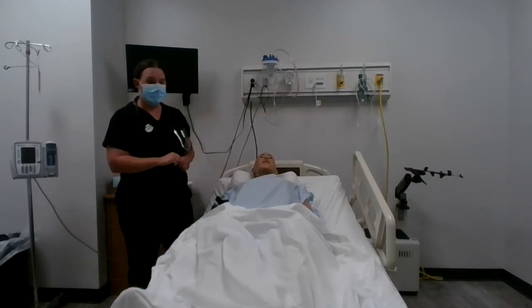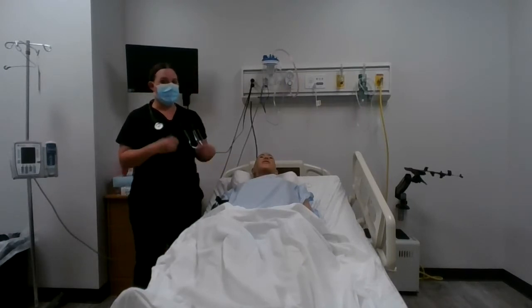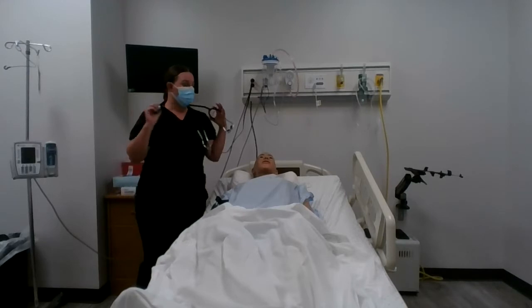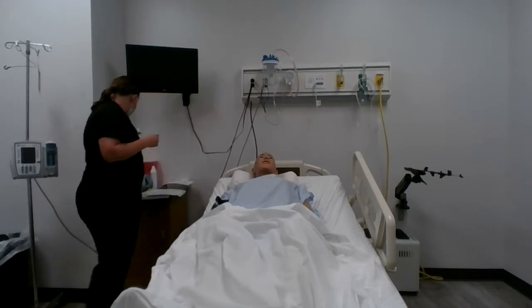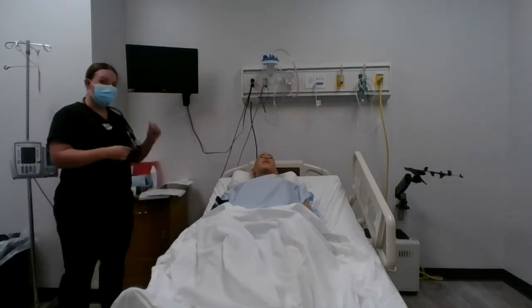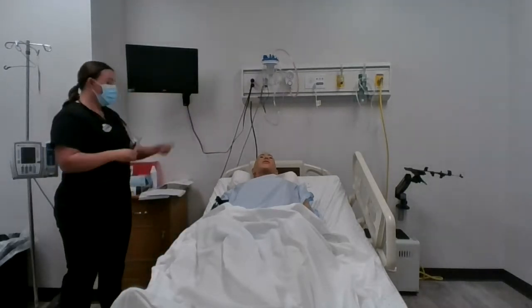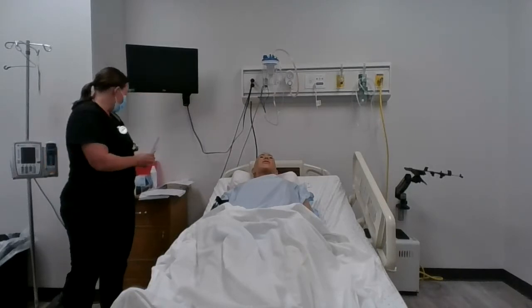Gather and prepare the necessary equipment. You're going to need a double stethoscope, which we will provide. We have gloves, a tongue depressor, and you're going to need a pen light and some alcohol swabs.